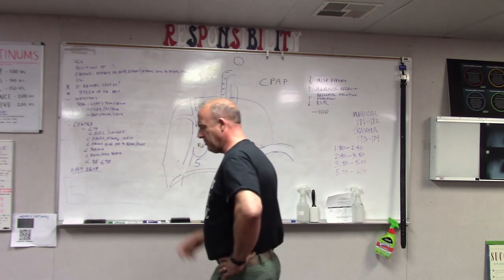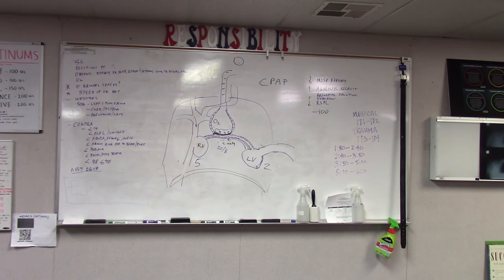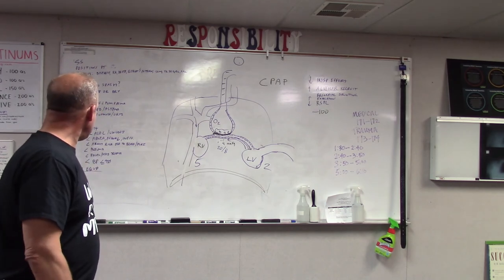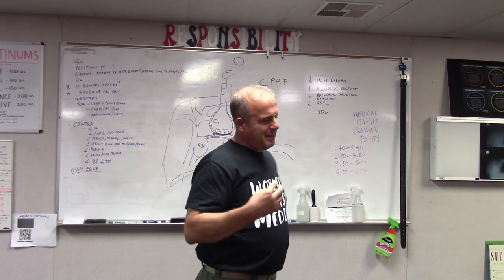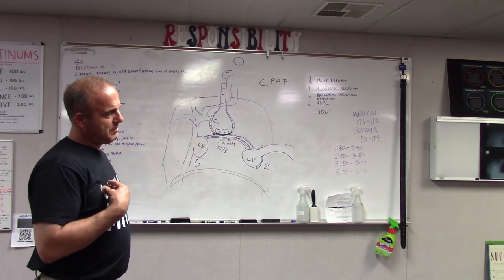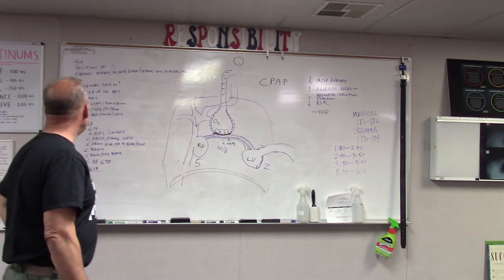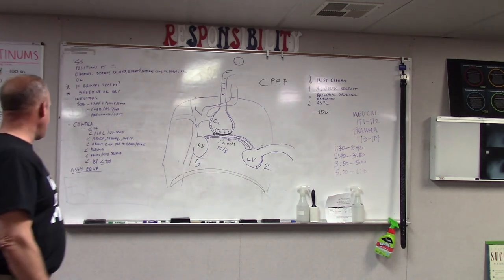Pneumothorax. Now, simple pneumothorax should not, but may be worsened by CPAP. Tension pneumothorax will definitely be worsened by it. And if you have an open chest wound and when they take a breath in, air bubbles in and then doesn't come out, that's bad. If it bubbles when I take a breath in, that's not bad. But rule of thumb, if you suspect a pneumo, don't do the CPAP on them.